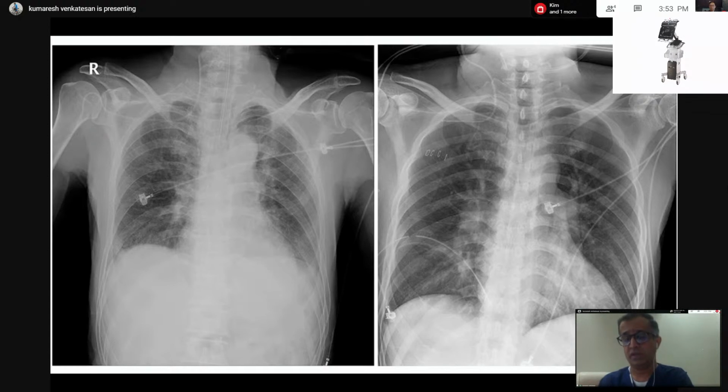And similarly, here the catheter which was inserted into the jugular vein has gone into the subclavian axillary vein. So by confirming where the guide wire is going, whether it's going into the brachiocephalic vein, you'll be able to confirm that you're heading in the right direction. And if you're not, you may be able to withdraw the guide wire and redirect it.